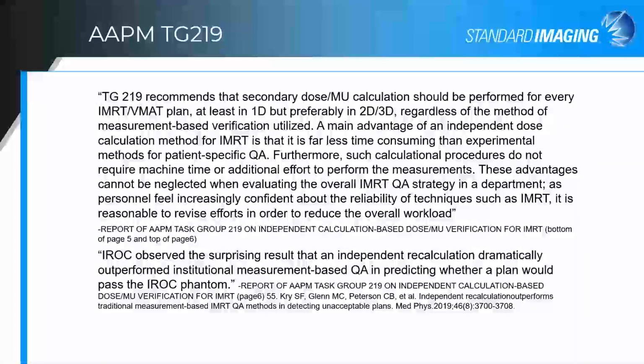I wanted to bring up AAPM Task Group 219 and just highlight a few items in a particular excerpt that I have pulled out of the document, particularly at the bottom of page 5, top of page 6, as I downloaded it from the AAPM website. So, of course, everyone's familiar that you should perform IMRT VMAT patient-specific QA.